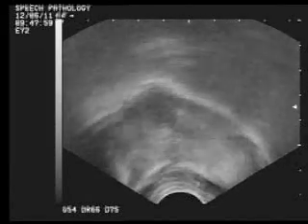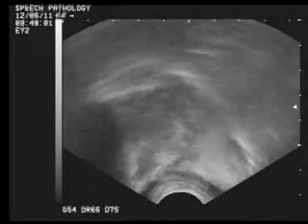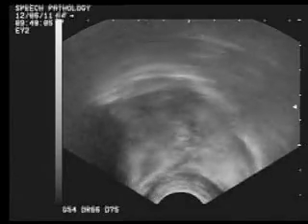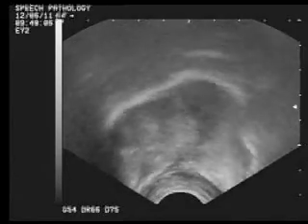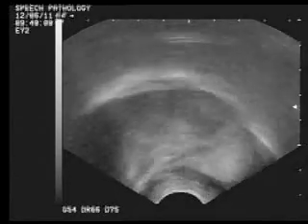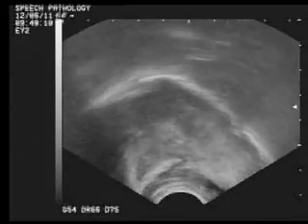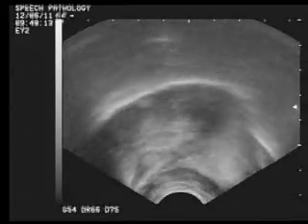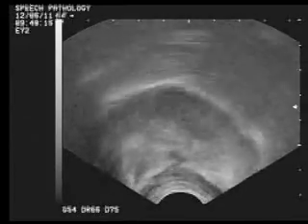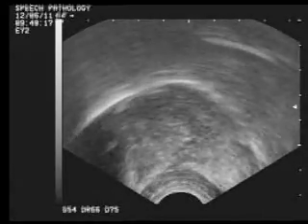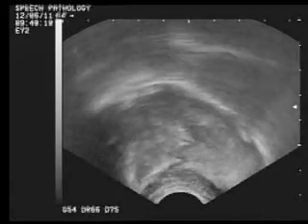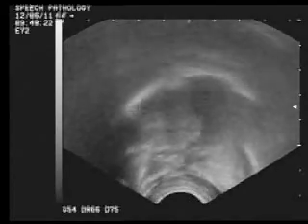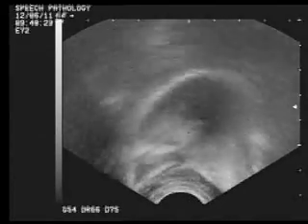This is a demonstration of my tongue during an ultrasound. This is a sagittal image of my tongue. On the left of the image, you can see the tip of my tongue. You can see the tip of my tongue move up when I say certain sounds.